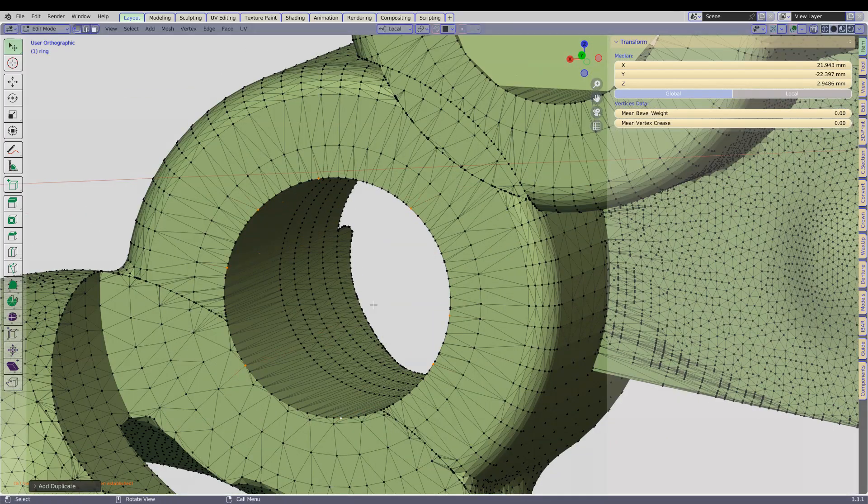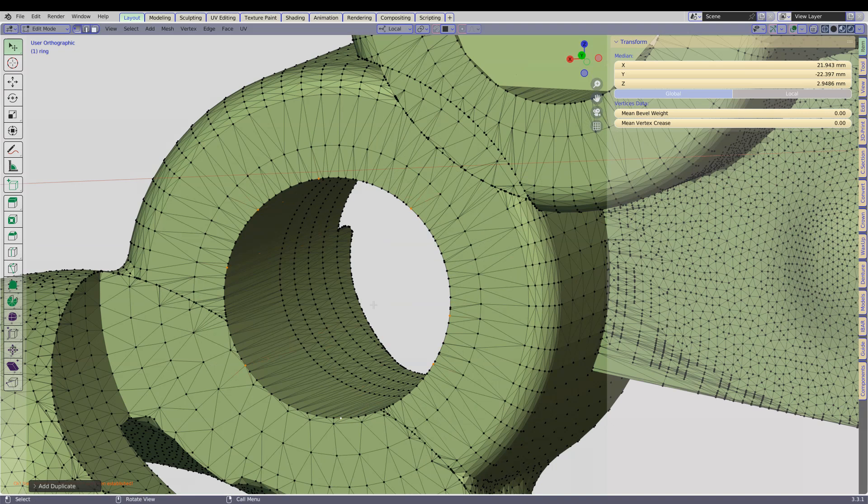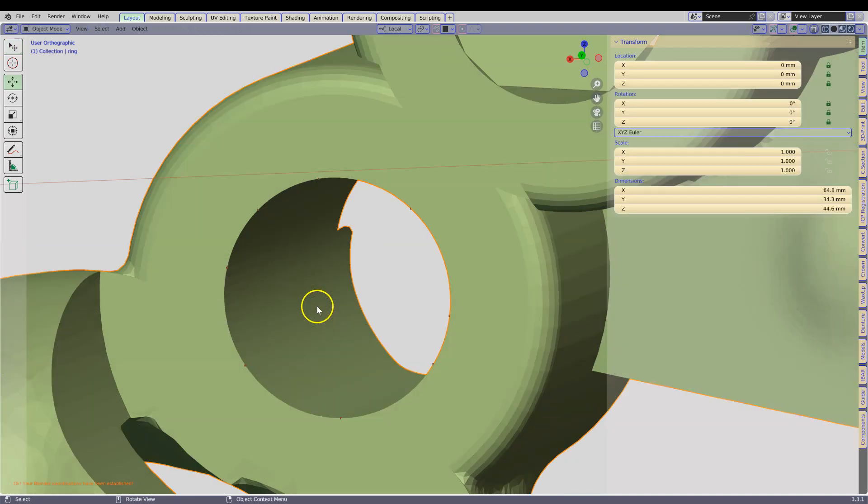Shift D, Enter, P by selection, Tab to get out of it, select your vertices.